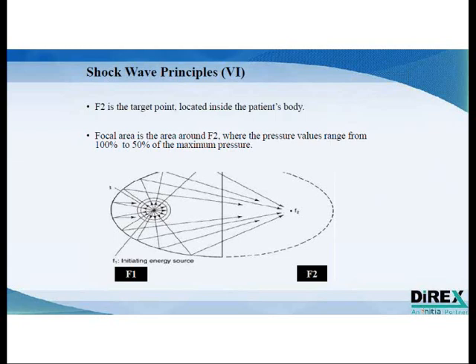Here is the theory behind this. If you generate energy at a focal point F1 on the left side, and this energy then bounces off the reflector, which you can see outlining the left side of the picture, all of the waves will converge onto F2, as you can see from the arrows. This allows for a buildup of a lot of energy onto one single focal point.